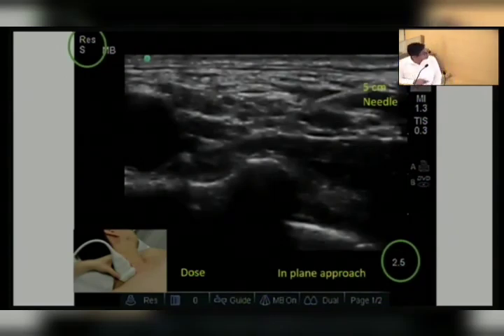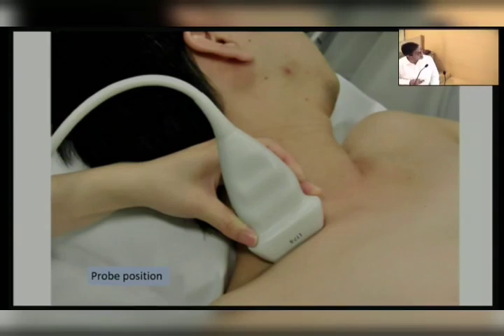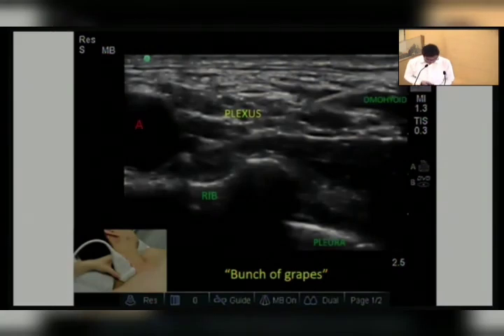And when we put the probe on the supraclavicular region, just like this, directing toward the thoracic inlet, we will find this screen. See, first of all, you have to trace the anechoic pulsatile subclavian artery, which is resting on the hyperechoic first rib, which gives you posterior acoustic shadow. And bilaterally, inferior to this hyperechoic rib, you will find the pleura that gives a posterior sliding sign. That is how you can identify which is pleura and which is rib.